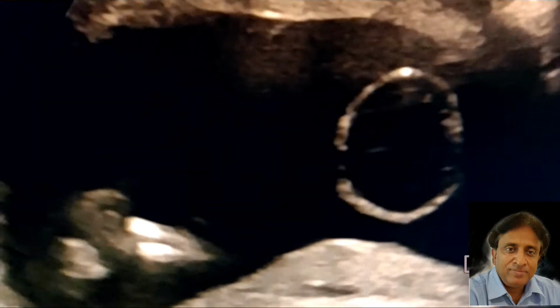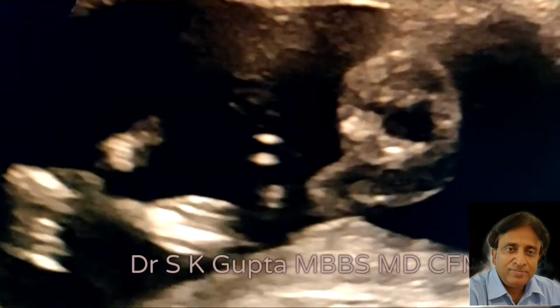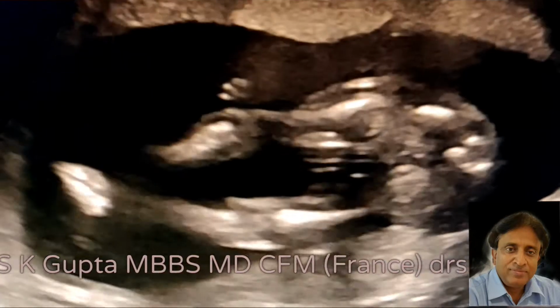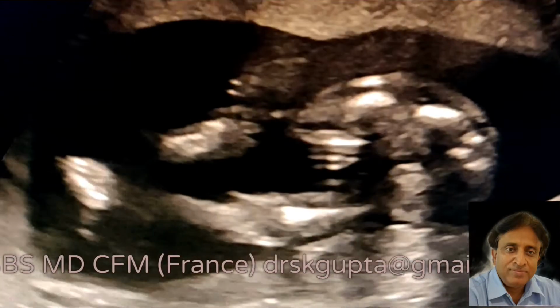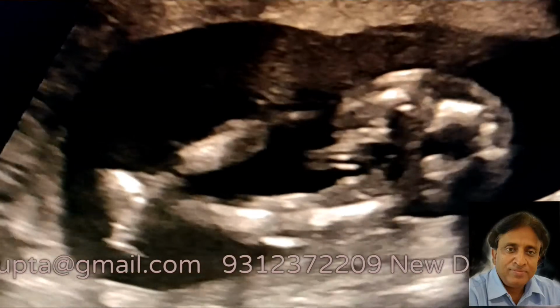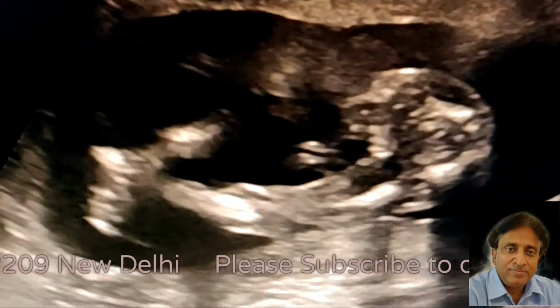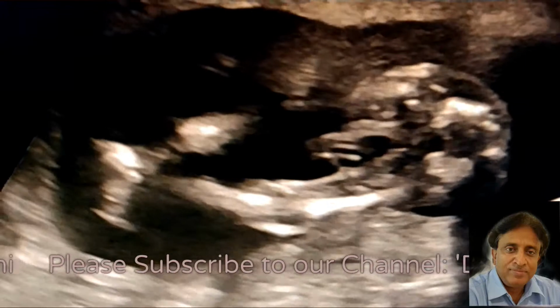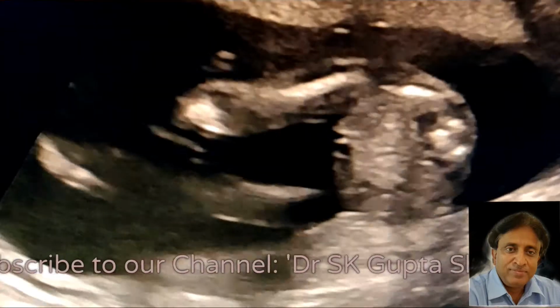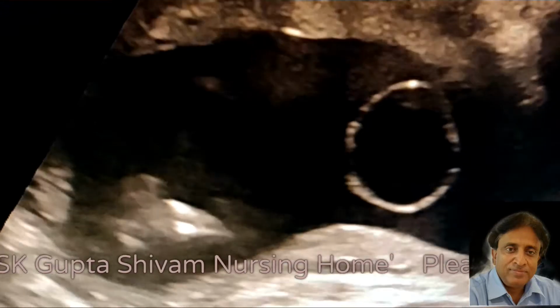Whenever we see a meningocoel or meningomyelocele, it is always imperative that you should look for the active movement of the limbs. Because the meningocoel or the meningomyelocele of the sacrococcygeal region are likely to affect the lower limbs, it is imperative that we should look for the active movement of the lower limbs, and that's what we are trying to see over here. These are the lower limbs, but are they moving normally? With time they should move, and there should be an active movement.